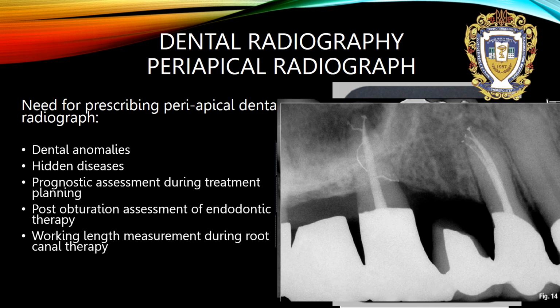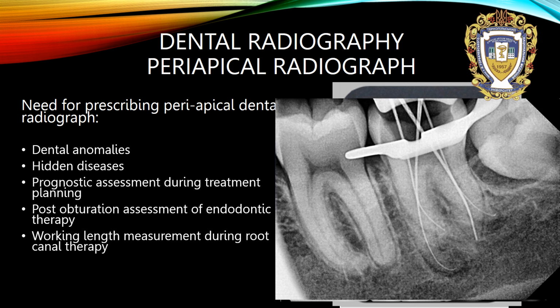Working length measurement during root canal therapy. As you can see, the doctor puts files into every root canal and takes an X-ray with those files in place. The length of every file must be measured and noted for future steps of endodontic treatment.